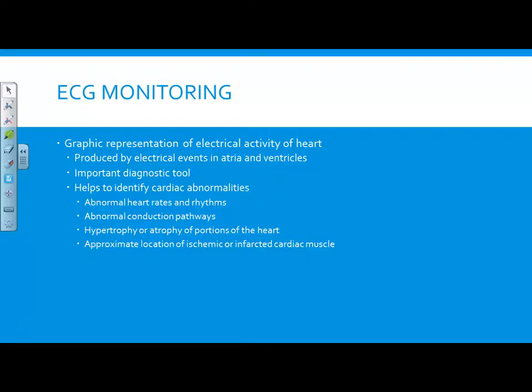So what we're about to do is take a step off into EKG monitoring. To understand how the EKG monitor works, you gotta understand what it is. It is a graphic representation of electrical activity in the heart. The heart has 2 functions. It has the electrical and the mechanical. This will only tell you what's happening electrically. Okay?